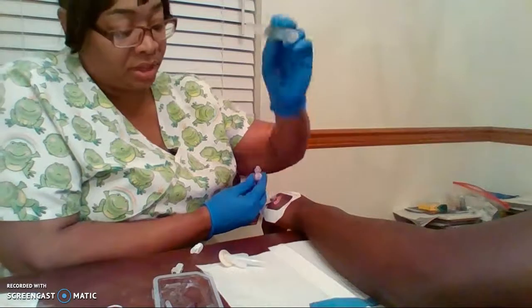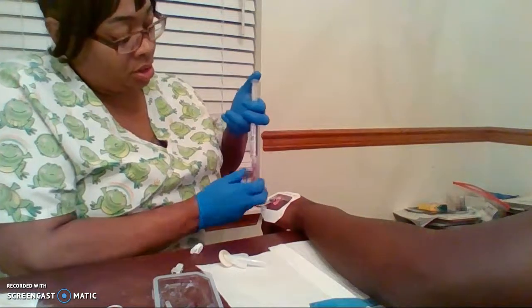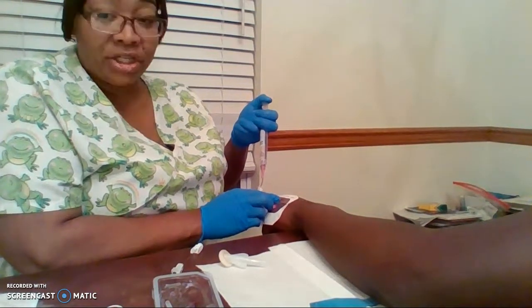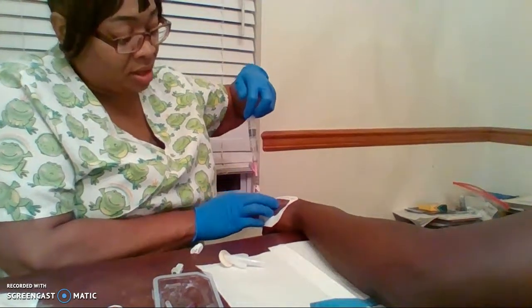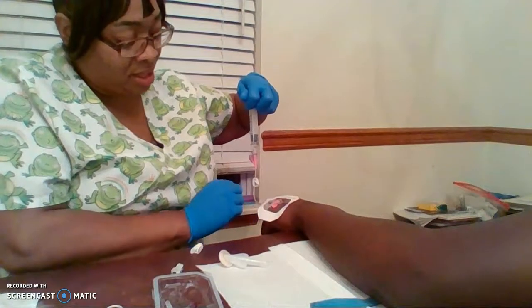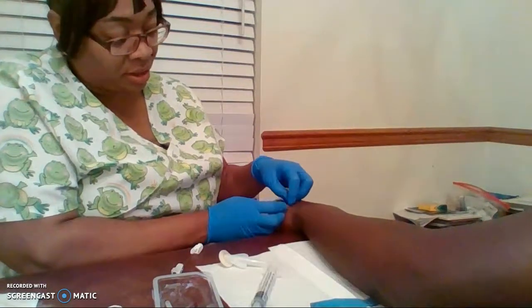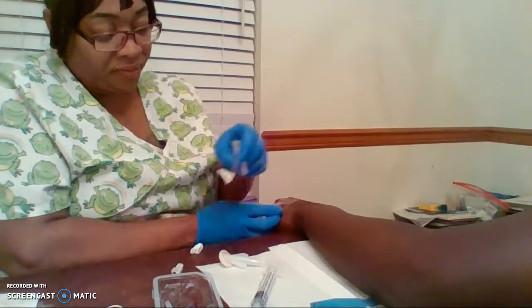At this point, you're going to attach a saline flush. Open up your line. You're going to flush it. And you're looking for signs of infiltration. Infiltration would mean where there is some bubbling at the site where the needle was inserted into the body, also above where the catheter is currently placed. If it flushes really well and the saline goes in smoothly and you don't see signs of infiltration, then it's safe to say that you have selected a good IV vein and site, and secured a really good IV.